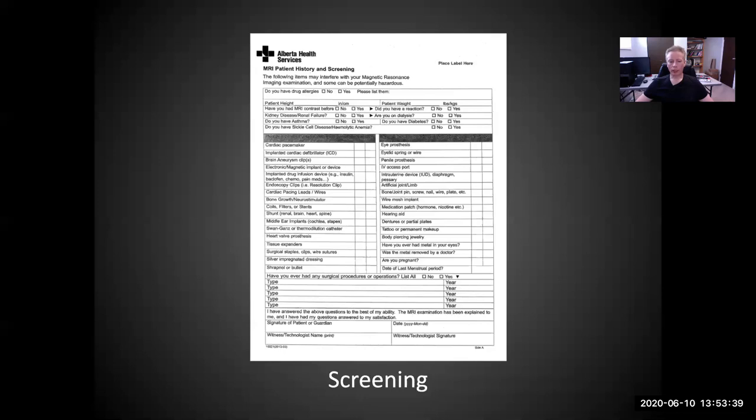So bottom line, if a person has a tattoo that is larger than the size of my palm, I would exclude them. And you can talk to your study lead if you have concerns about that particular one. It would only be probably in exceptional cases that you would want to scan someone like that and then have a technologist as the operator.